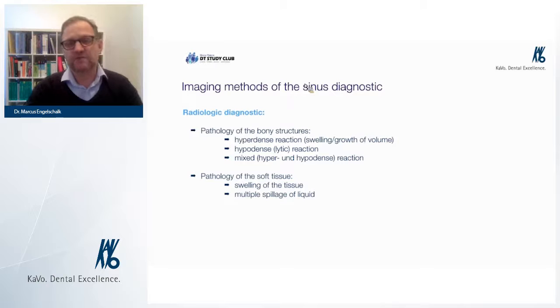First of all, I don't want to lecture today about the X-ray topics in depth, but I want to give you some information about the things we do for the internal sinus floor elevation. The thing is, during an X-ray examination, we have to know what we want to find or what we want to see if we do the X-ray.